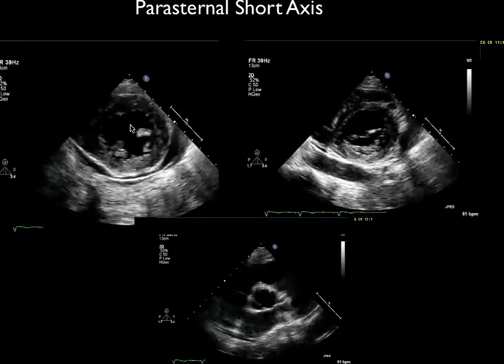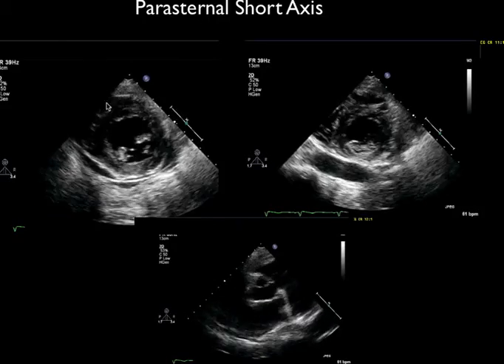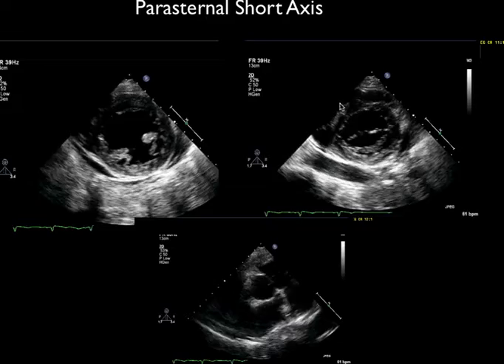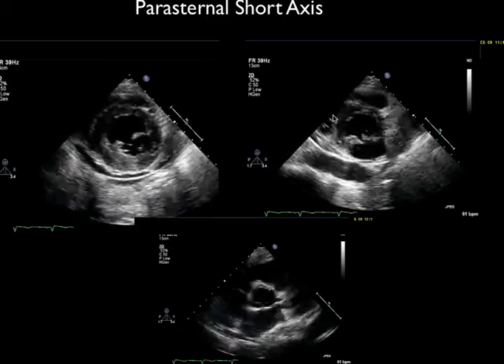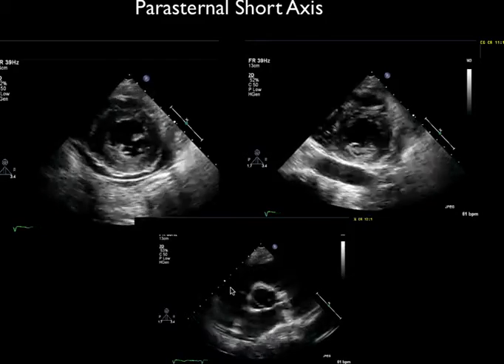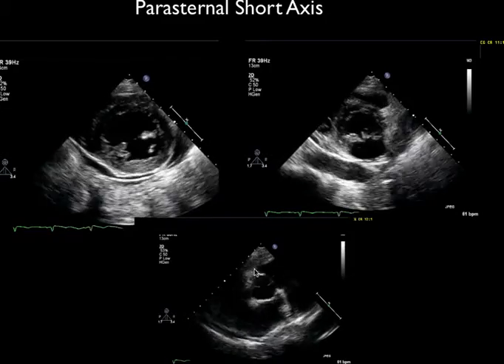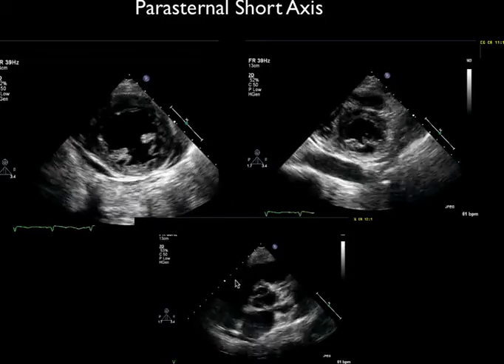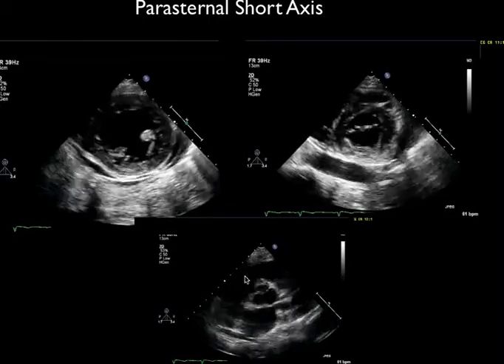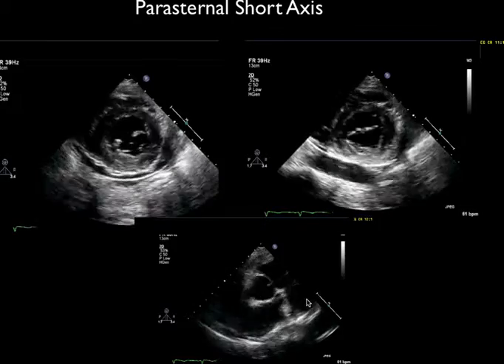Now this whole structure here is all left ventricle. There's a little tiny piece of the right ventricle seen over here. Again, all left ventricle. Little sliver of right ventricle is seen up here. Much more right ventricle is seen over here on this more proximal view. And eventually you get to see the right ventricular outflow tract as it comes down to the pulmonary artery this way.